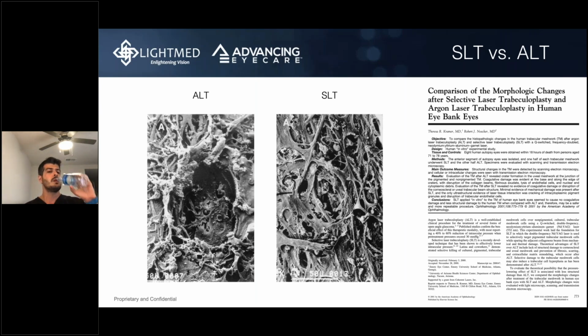Okay, this next question is from a physician that says, if a patient had an IOP of 27 and was treated for several years with drops, and now you do a 2-week washout of drops, will you still get a poor response to SLT? The answer is no. When you do a washout period, you're going to get a great response to SLT, and this patient's pressure is 27 with an eye drop.